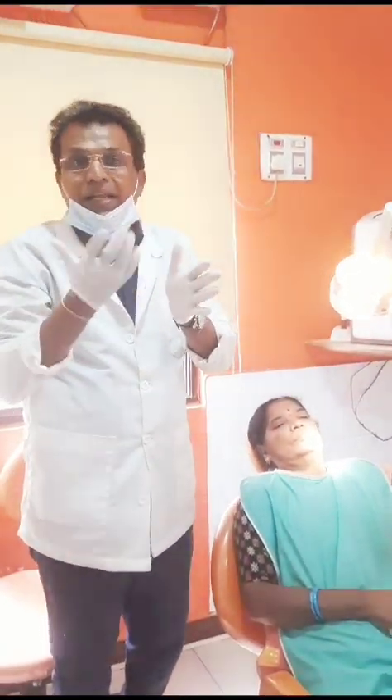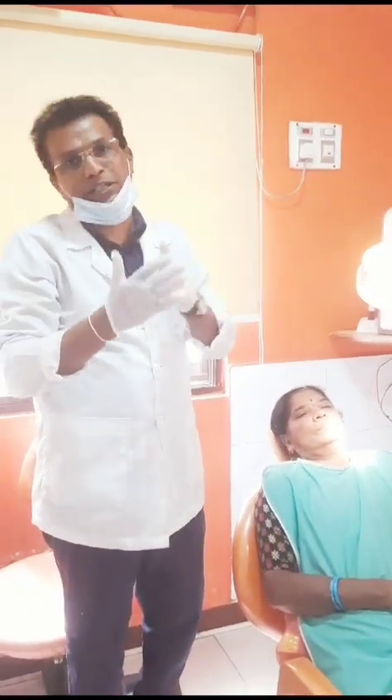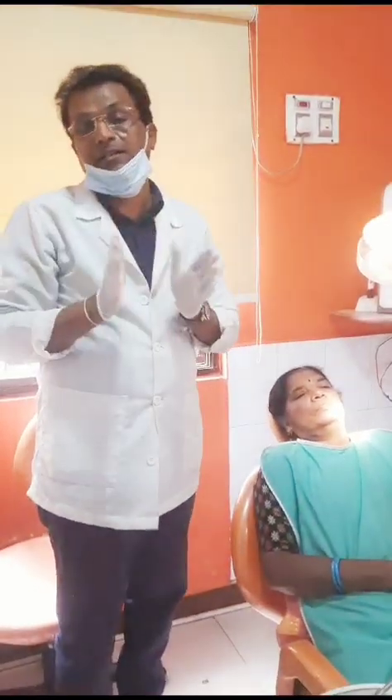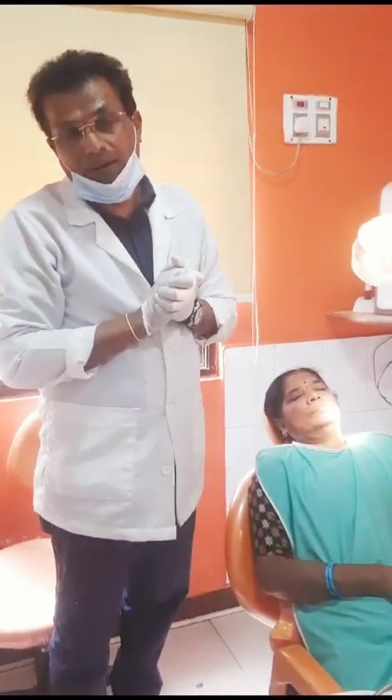These are bendable implants, around 3.5mm in width, and the length can be around 14 to 16mm, 18mm, or maximum up to 20mm depending on the bone. In this case I have used 16mm and 18mm implants.